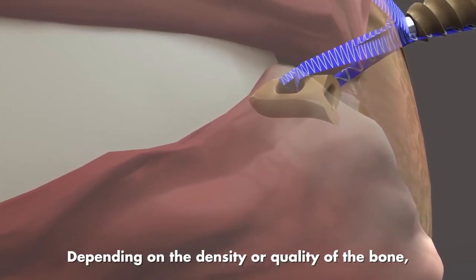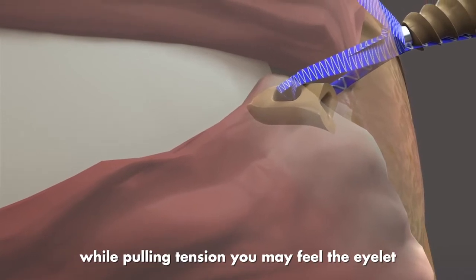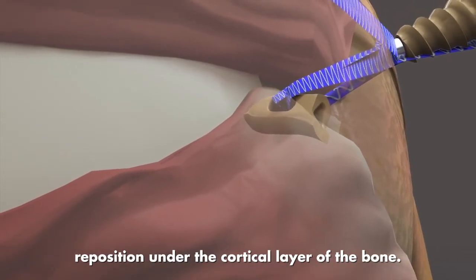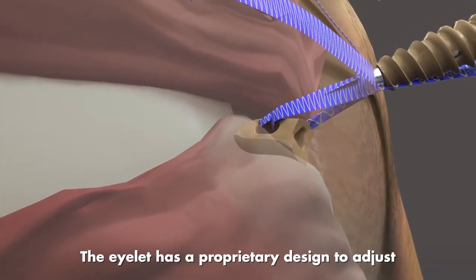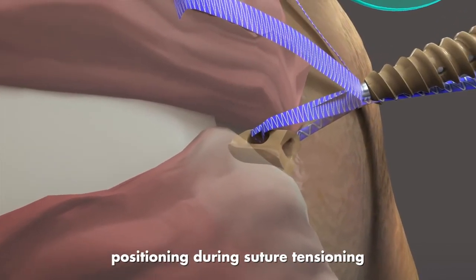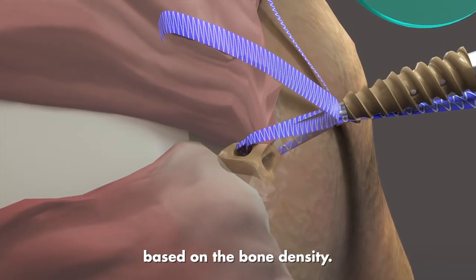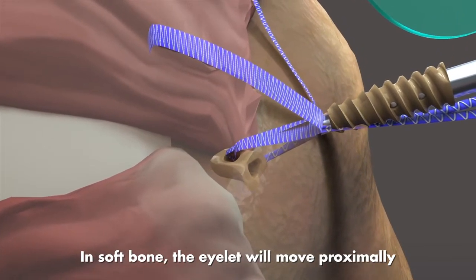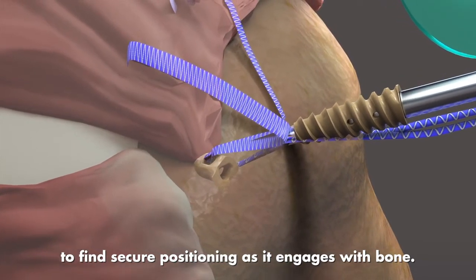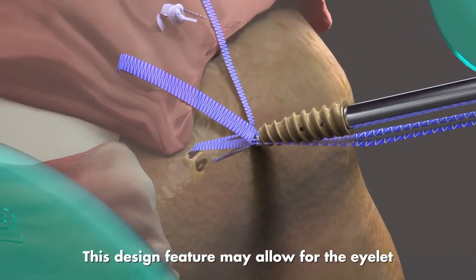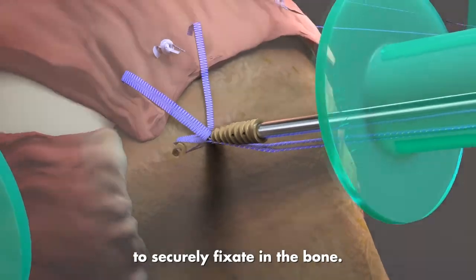Depending on the density or quality of the bone, while pulling tension, you may feel the eyelet reposition under the cortical layer of the bone. The eyelet has a proprietary design to adjust positioning during suture tensioning based on bone density. In soft bone, the eyelet will move proximally to find secure positioning as it engages with bone. This design feature may allow for the eyelet to securely fixate in the bone.